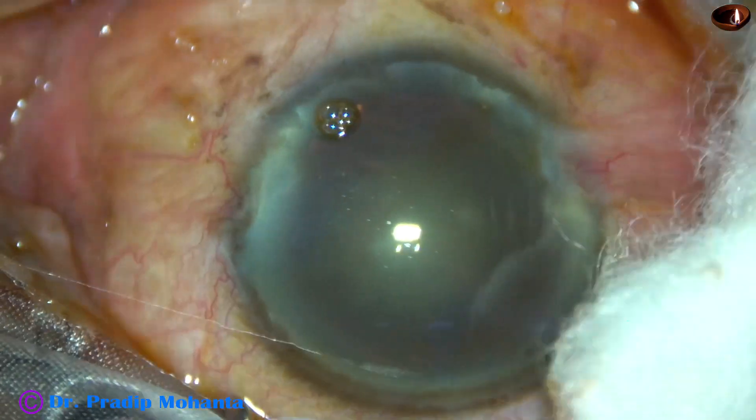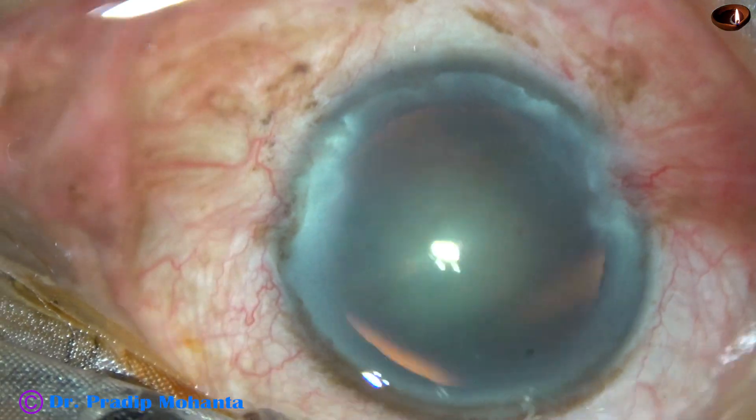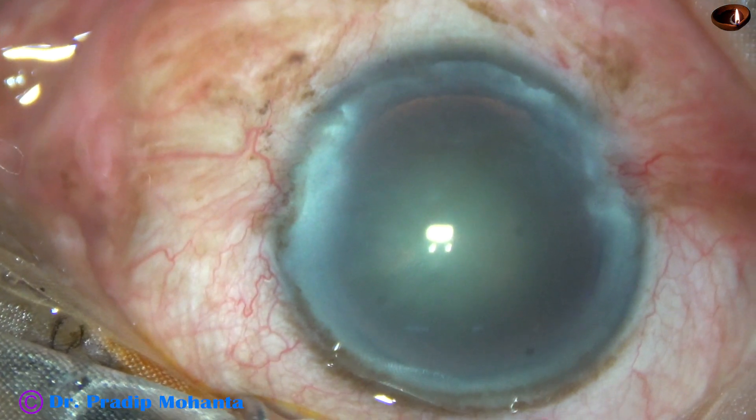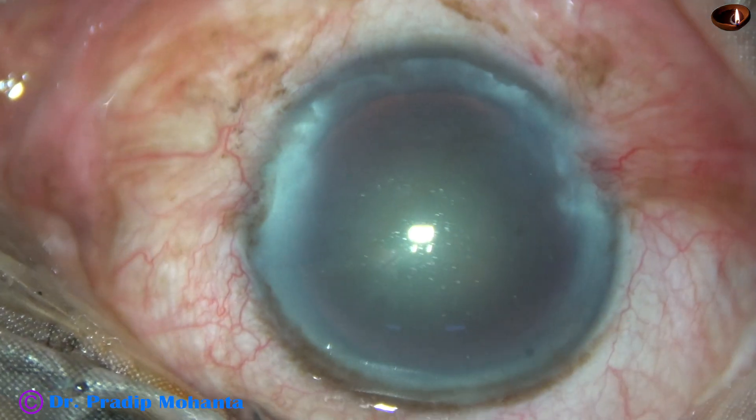Some amount of povidone iodine is applied over the ocular surface. The ocular surface is thoroughly irrigated and then nicely wiped out. Again, three more drops of proparacaine are applied.